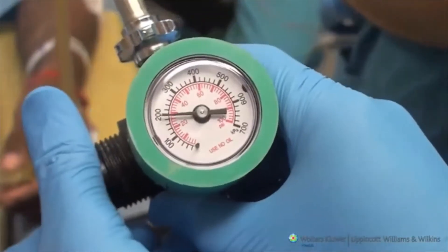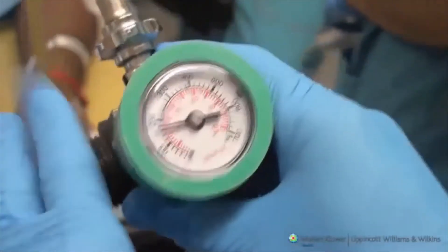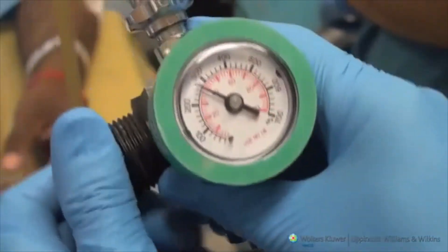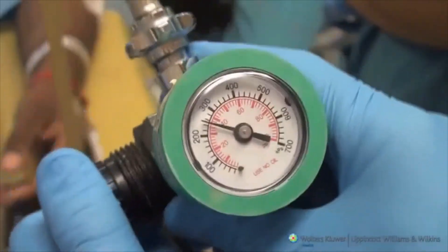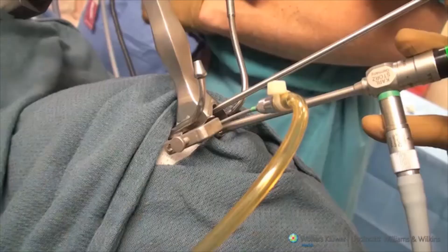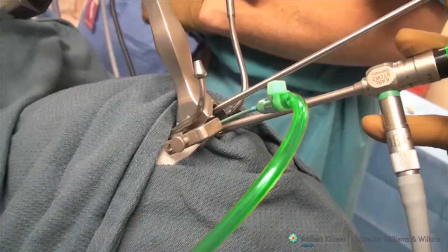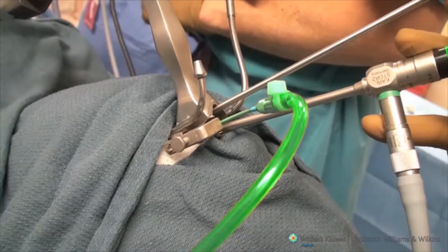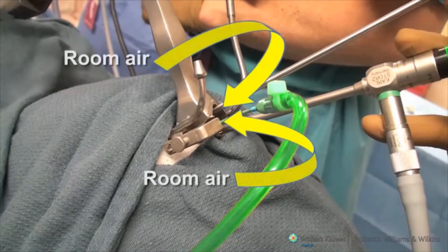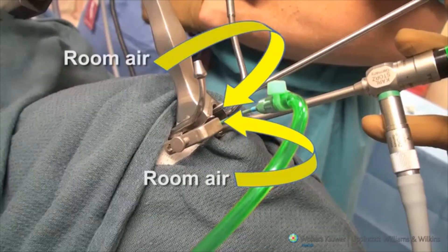The maximum deliverable pressure can be set using the adjustable flow control valve to minimize the risk of barotrauma. It is important to understand that the jet of oxygen entering the suspension laryngoscope entrains room air, which results in a variable FiO2.